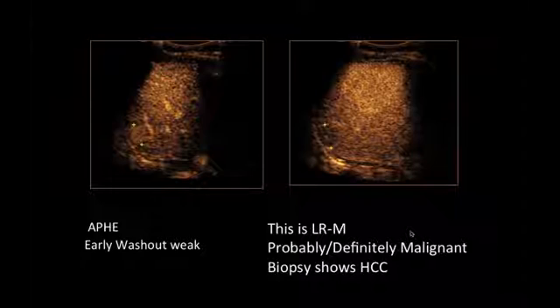So when we look at this, these are basically the nodules that Dr. Pascalia was describing in his very nice description about the hepatocarcinogenesis, the change of cirrhotic nodules through to first well and then poorly differentiated HCC. And so what are the things that we look at when we're looking at this spectrum of nodules?